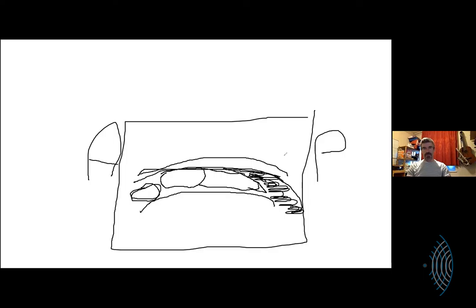And that's all black because that's all infraspinatus, coming in at a different angle, going over the top of the supraspinatus. I'm sure I have a video of it somewhere. Sometimes I'll be bored, so I'll pick them out and show my students, because all you need to do is angle the probe slightly differently. I had to know it was there to even play with it, John.